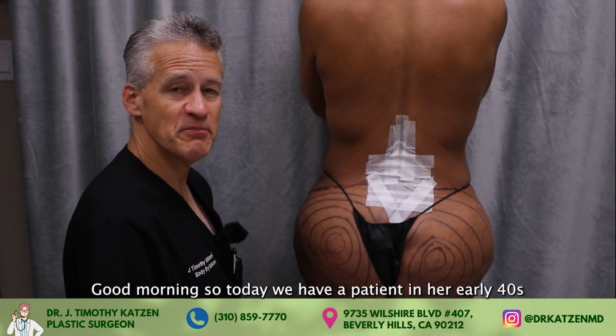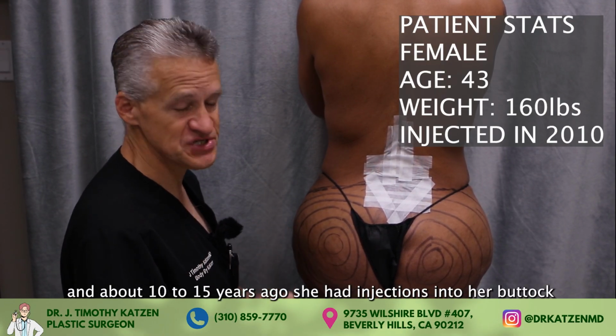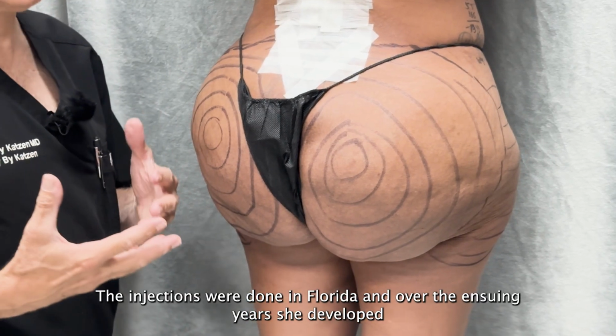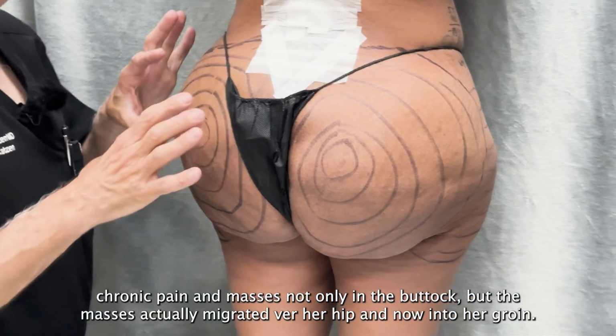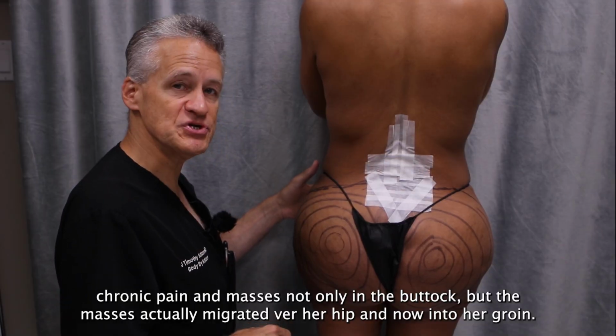Good morning. So today we have a patient in her early 40s, and about 10-15 years ago she had injections into her buttock. The injections were done in Florida, and over the ensuing years she developed chronic pain and masses not only in the buttock, but the masses actually migrated over her hip and now into her groin.